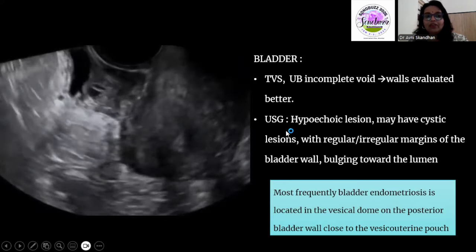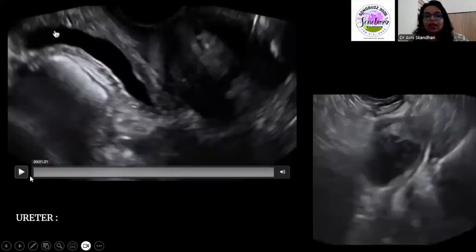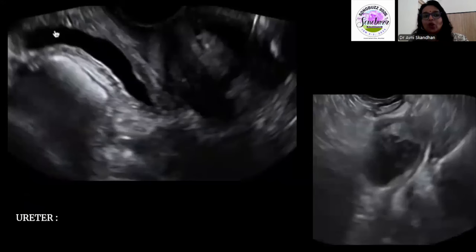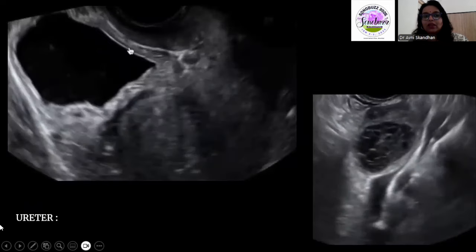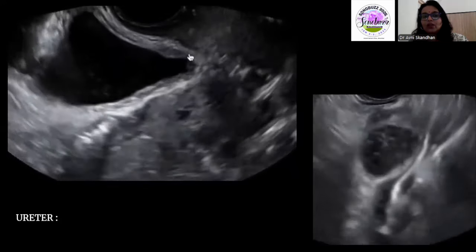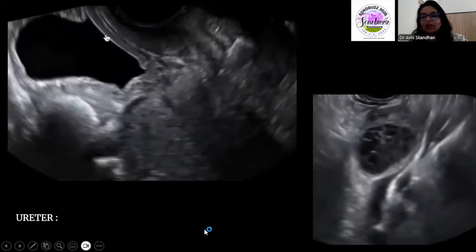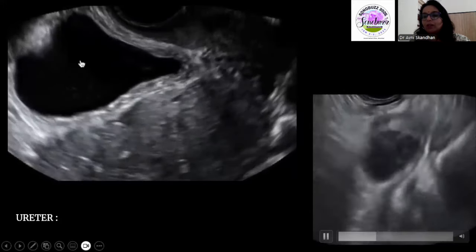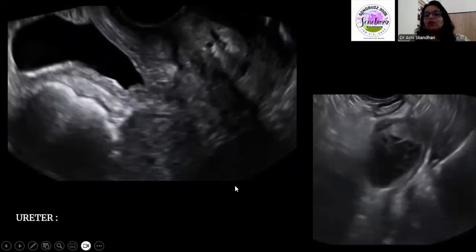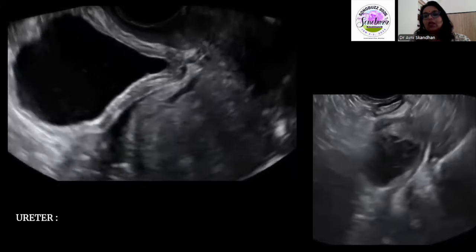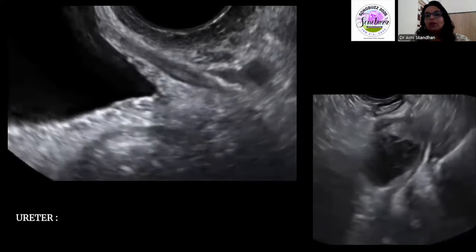We should also comment on whether the deposit extends into the vesicouterine pouch. We can also look at the ureters — in a normal patient, the distal end of the ureter can be picked up. Here you can see the base of the bladder and the trigone with the ureter coming off. In another example, an endometriotic cyst is causing compression of the distal ureter with proximal dilatation; importantly, it is the adjacent fibrosis — not the endometrioma size itself — that is causing the compression.